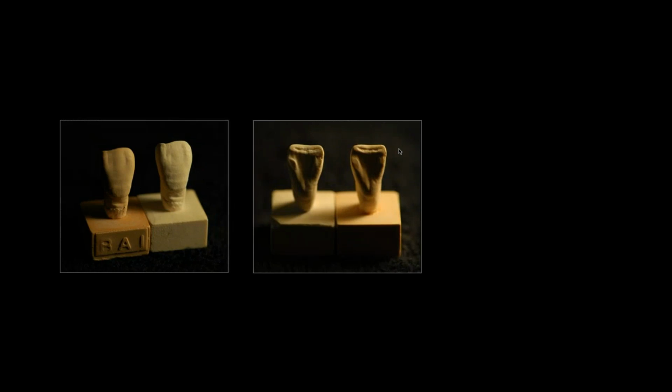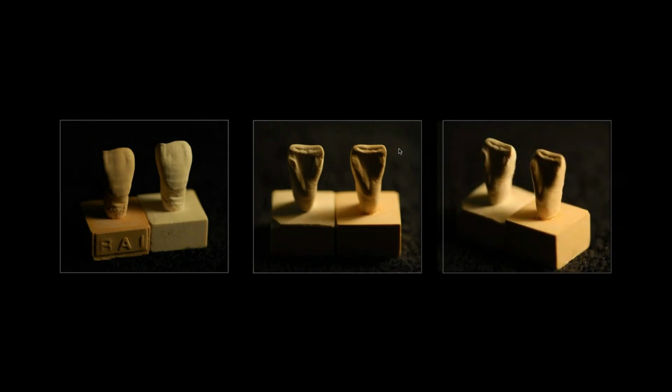So here on this slide you can see this carved tooth from different angles. You can see that the middle picture is not exactly the same, but it is almost the same, and our goal is to mimic the natural tooth as closely as you can. In every dimension, in volume, in everything, you need to copy exactly the same tooth.